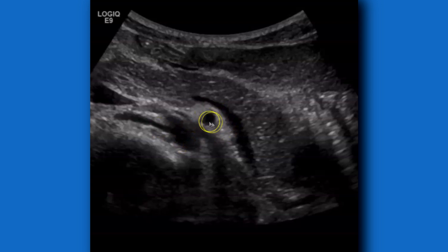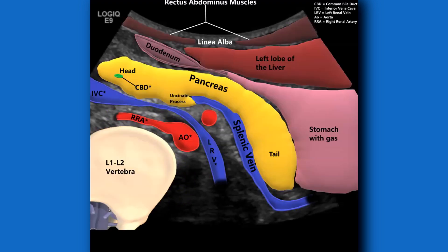Continuing on, we have the SMA and the aorta. It's important to know that the IVC is here, and the left renal vein goes between the SMA and aorta — a good view if you're trying to rule out nutcracker syndrome, which I did a video on recently. The aorta is here, and the vertebrae are probably L1 to L2; the head of the pancreas is usually by L2. Here's a diagram with all the labeling: rectus abdominis bilaterally, linea alba, left lobe of the liver, stomach, and duodenum or at least the duodenojejunal junction.